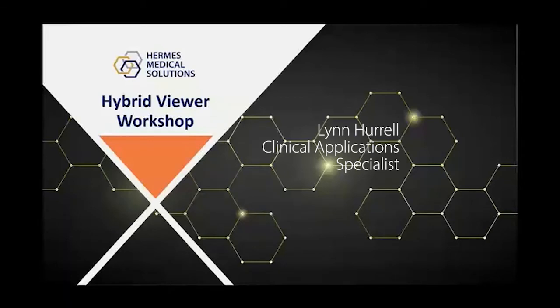Thank you very much for that introduction, Steve. As Steve said, a lot of you will know me. I'm a clinical application specialist for Hermes Medical, and I've worked with the company for 5 years or so now. I have recently been spending a lot of time working with Hybrid Viewer, mainly migrating customers over from classic applications to the Hybrid Viewer platform. I am also involved in the testing of the new releases that come out. So I'm going to be presenting today on some of the new features that are coming in version 6.